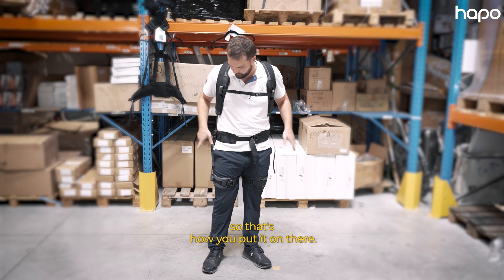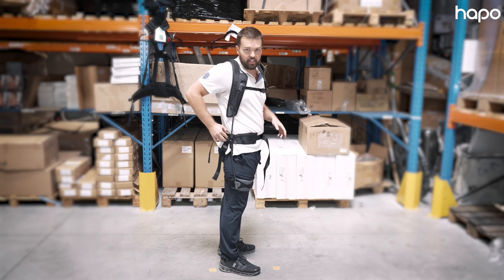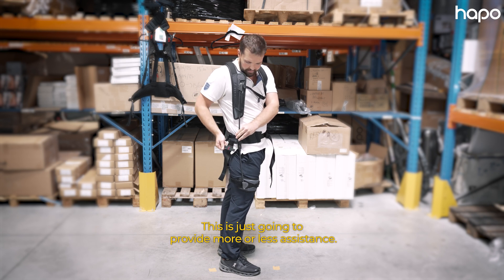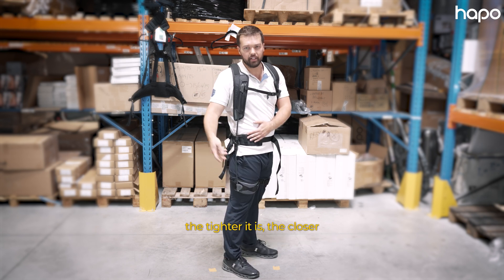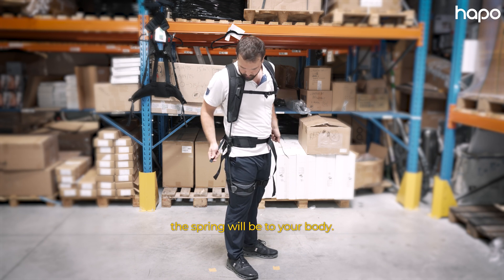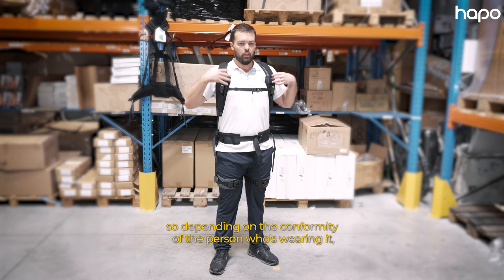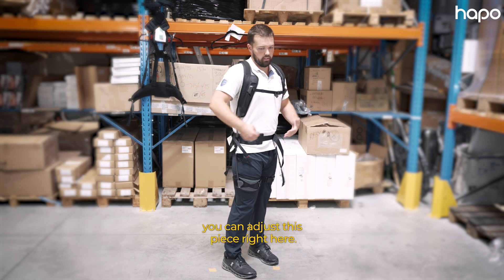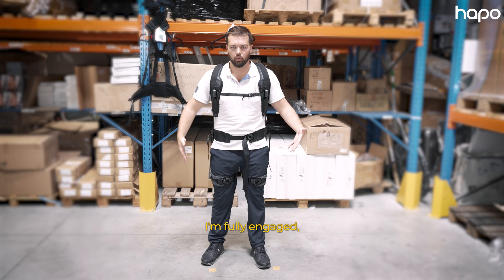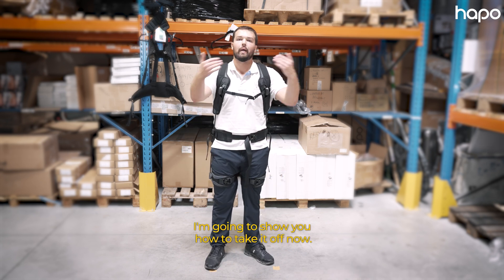So that's how you put it on. There are these red tabs here which provide more or less assistance — the tighter it is, the closer the spring will be to your body. So depending on the conformity of the person who's wearing it, you can adjust this piece right here. Right now I'm fully engaged and comfortable, and I'm going to show you how to take it off now.